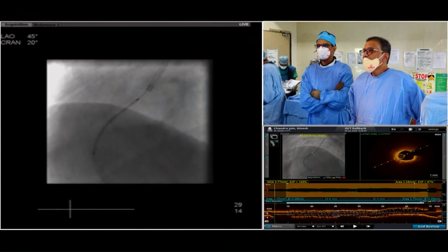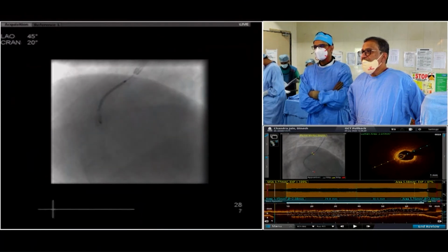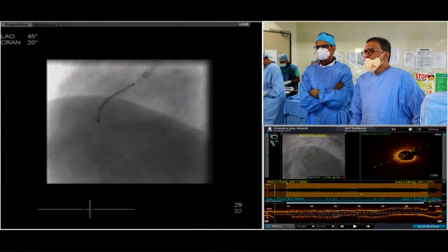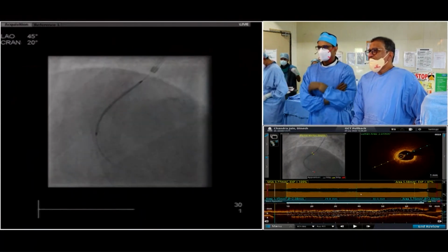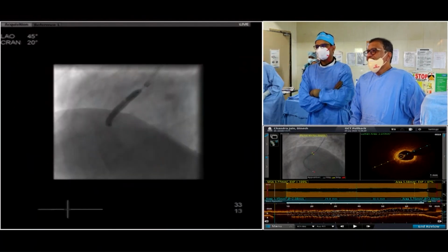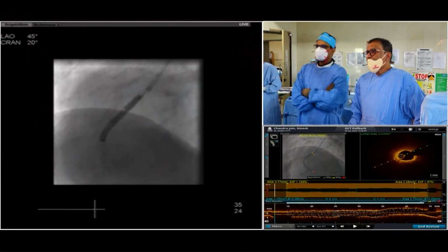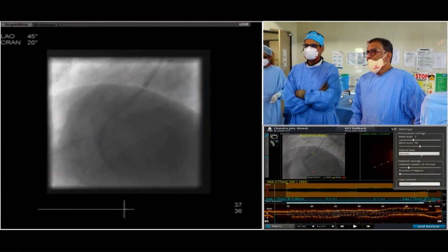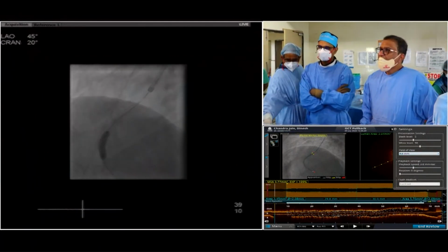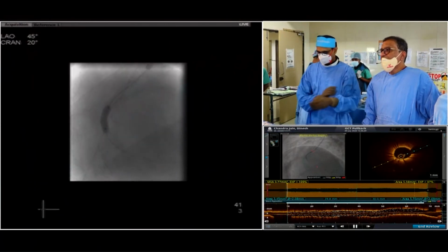Yeah, this is the proximal. This is where we left you. And the proximal stent is again a 3 into 38. We inflated nominally here. Next. We just did the overlap. Then we probably did one overlap with the 3 millimeter stent, and you implanted the stent, performed post-dilatation and then OCT.